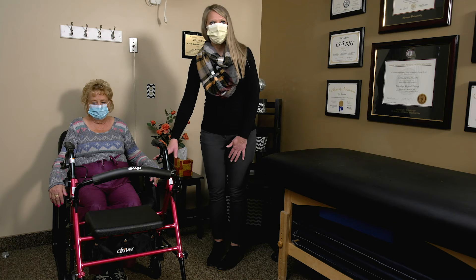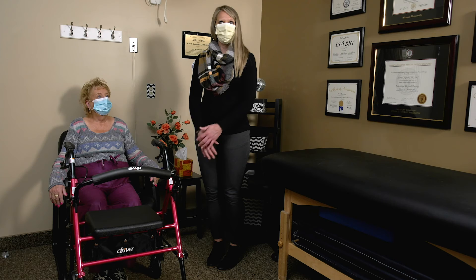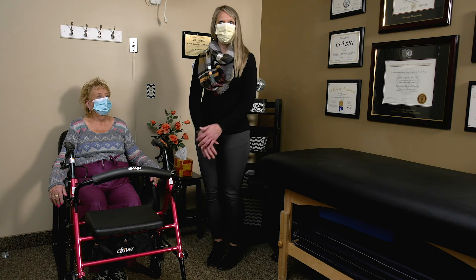However, always make sure it's safe before you sit on it — make sure the brakes are locked and put the back of the walker up against a stable surface if you're able to find one. Also, you never want to use this type of walker as a wheelchair — don't sit on it and scoot forward, because that could result in a fall.